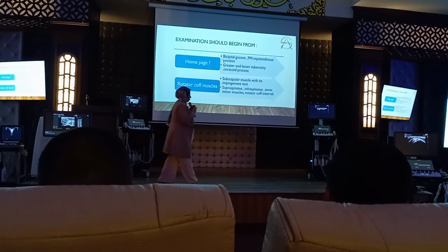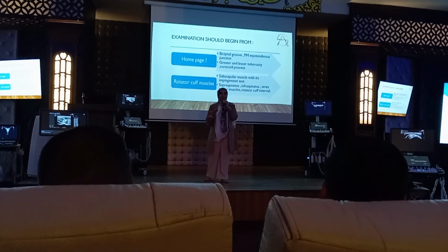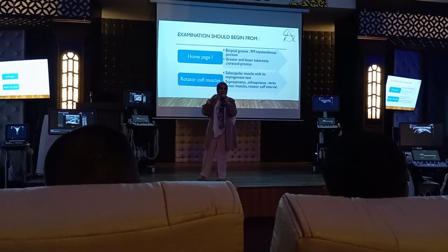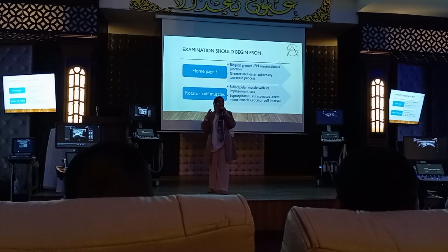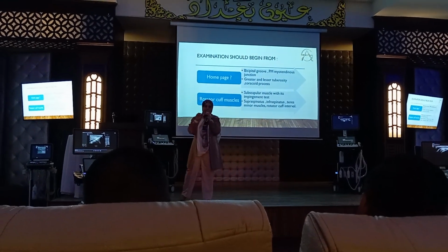So now, how to do ultrasound? When doing ultrasound, there is something called the home page. What is the home page? It is something you go to when you examine, and when you forget or lose the structure, you can return back again to the home page. So it is a landmark for you. You can return to it and begin again when you lose some structure.